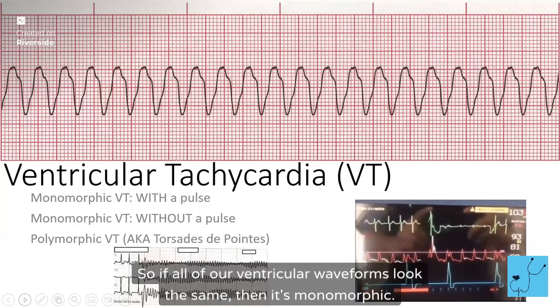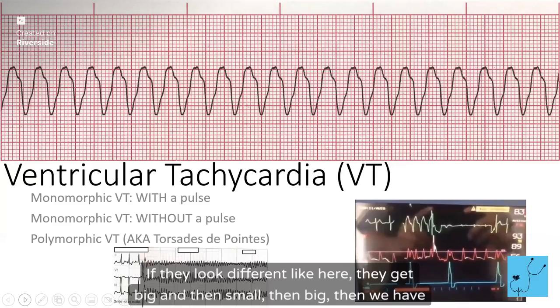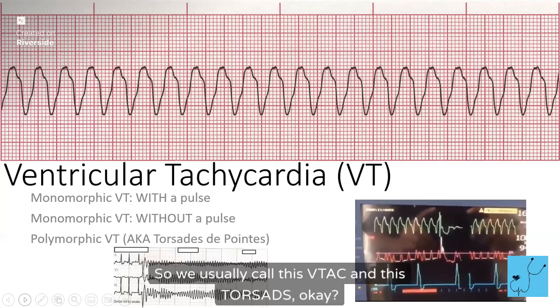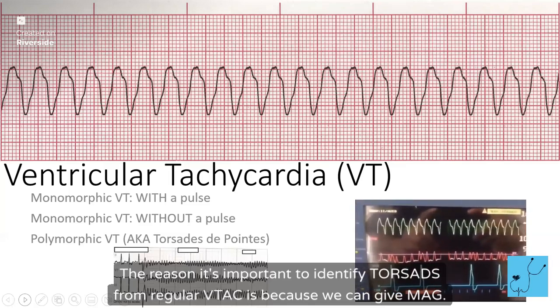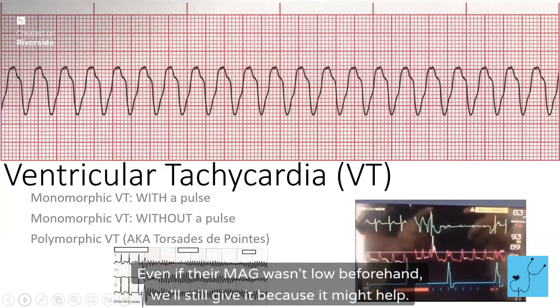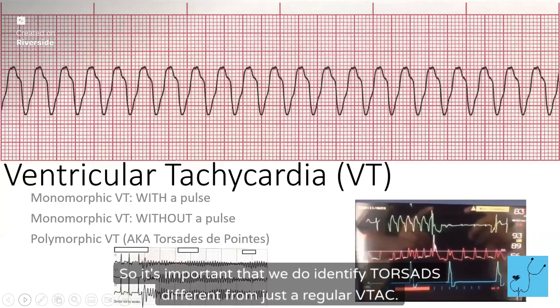If all of our ventricular waveforms look the same, then it's monomorphic. If they look different, like here, they get big and then small, then big, then we have polymorphic VTAC. So we usually call this VTAC and this torsades, okay? The reason it's important to identify torsades from regular VTAC is because we can give MAG. We know through research that MAG often helps. Even if their MAG wasn't low beforehand, we'll still give it because it might help, and it's probably not going to hurt them, okay? So it's important that we identify torsades differently from a regular VTAC.